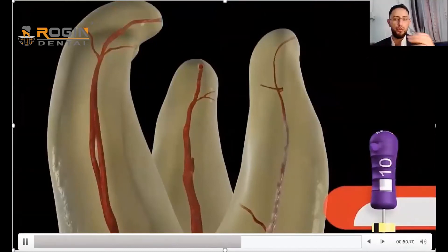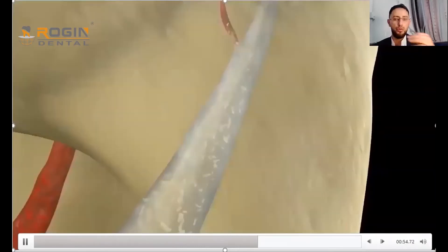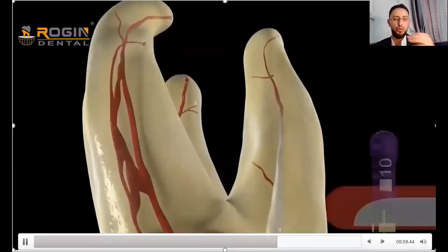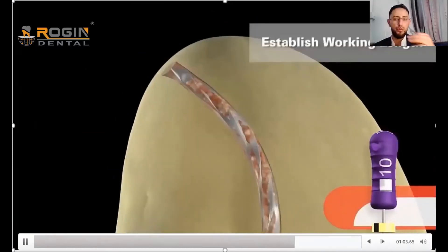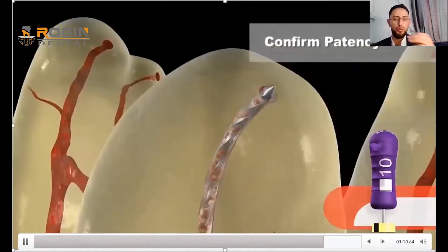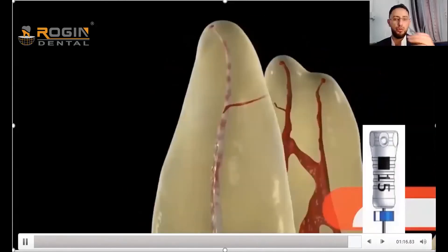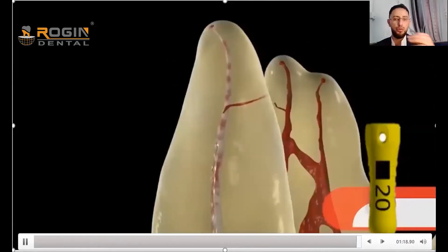We start with file number 10 K-file stainless steel. Our motion should be a mix of winding and filing techniques — all techniques should be used, especially in curved canals, calcified canals, and narrow canals, until we reach the working length. Between each insertion, we must apply irrigation with sodium hypochlorite, which we will discuss further.